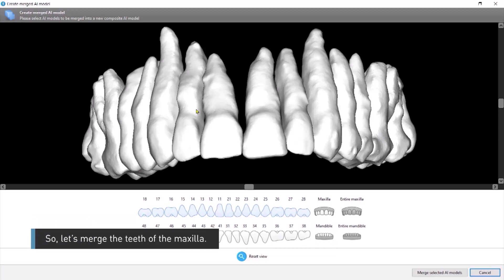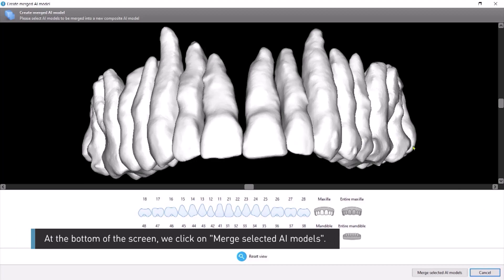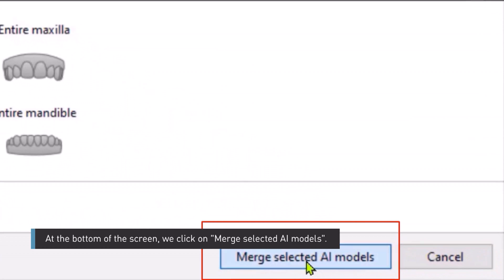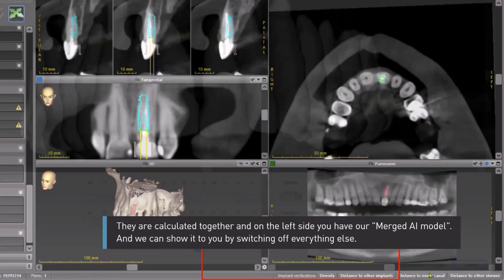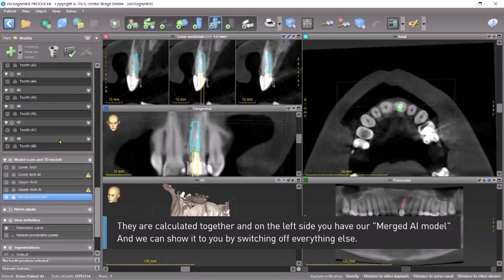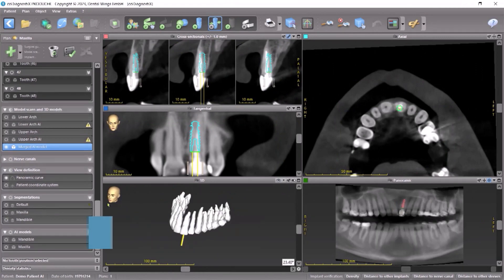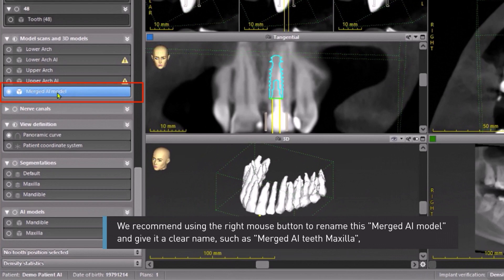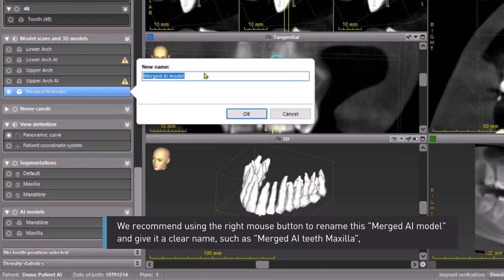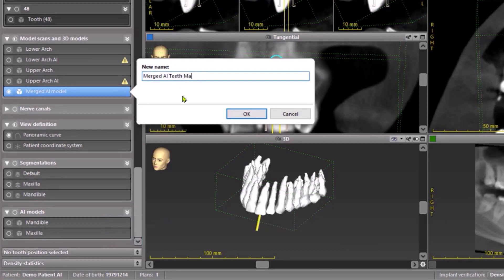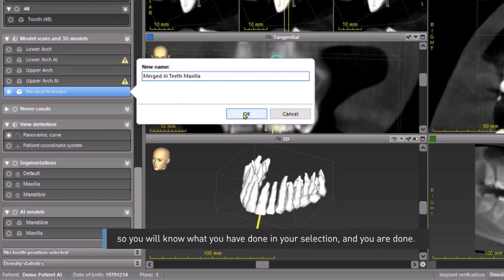Let's merge the teeth of the maxilla. At the bottom of the screen, we click on Merge Selected AI Models. They are calculated together, and on the left side you have the merged AI model — we can show it by switching off everything else. We recommend using the right mouse button to rename this merged AI model and give it a clear name, such as Merged AI Teeth Maxilla. That way you will know what you have done in your selection, and you are done.